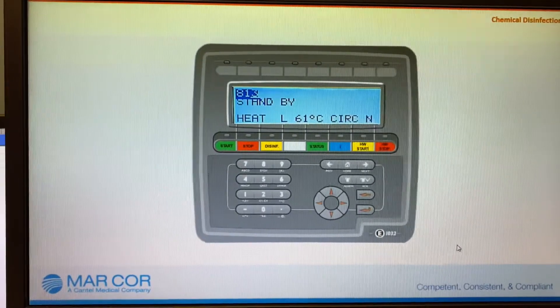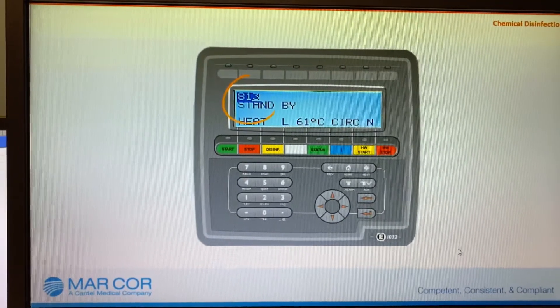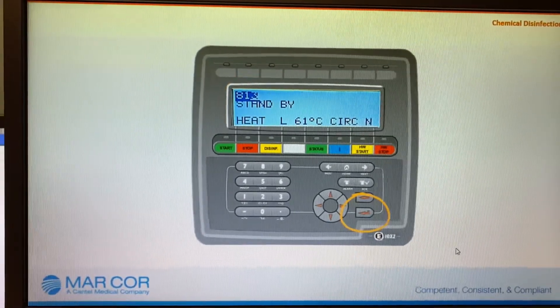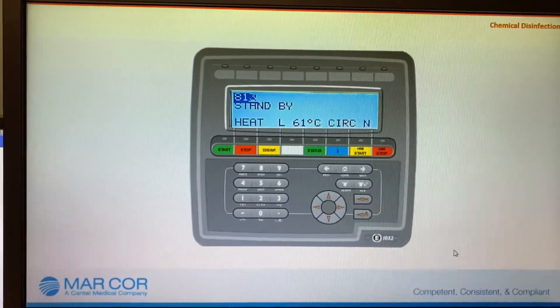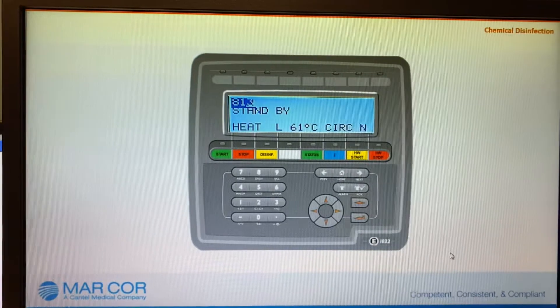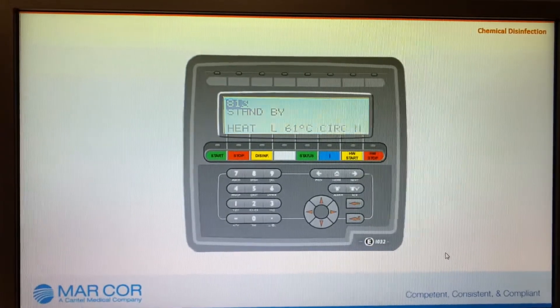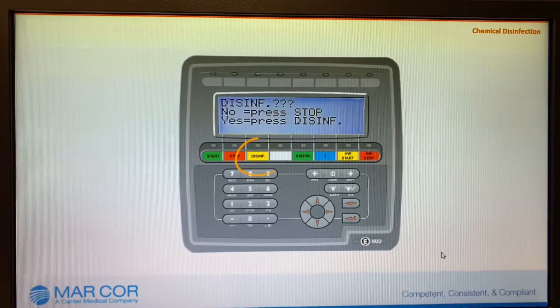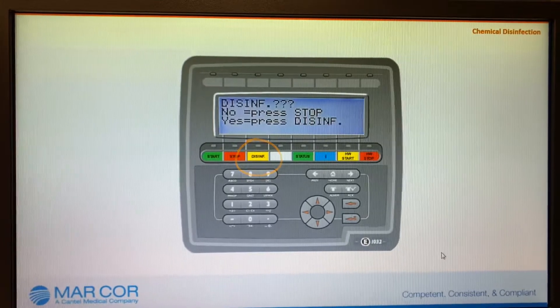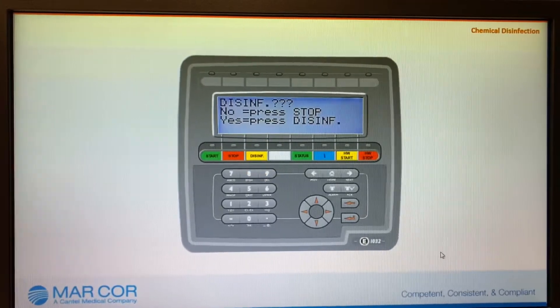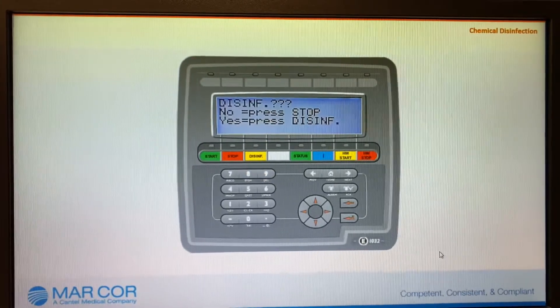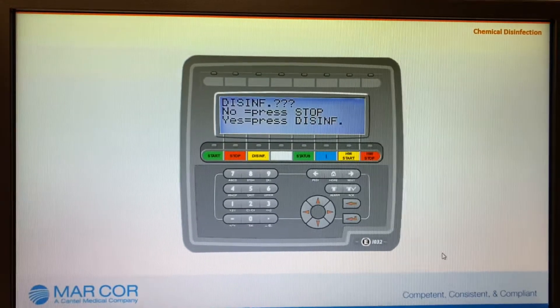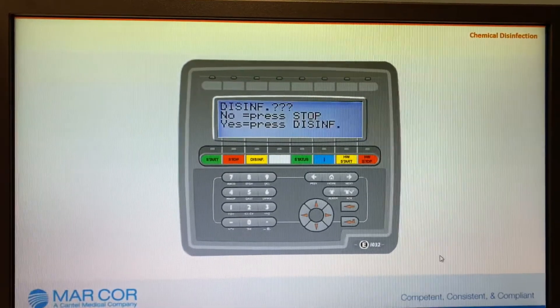Enter the operator's code 813 and press enter. This is not required if a manual hot water circulation has just been initiated. Press disinfect, then press disinfect again if disinfection is to be performed. A double entry requirement is a precaution to prevent accidental initiation of a chemical disinfection.